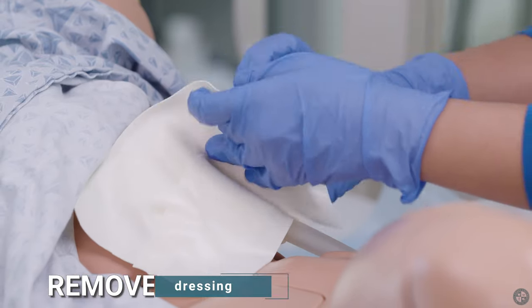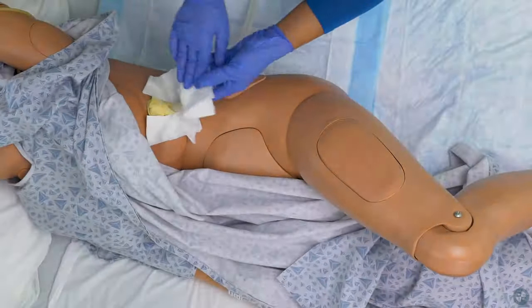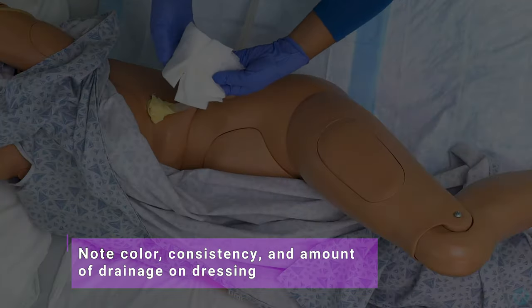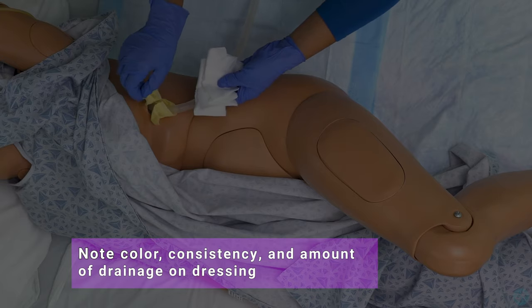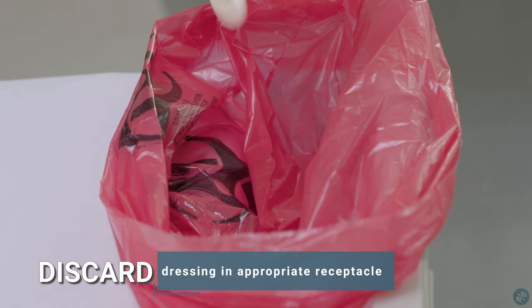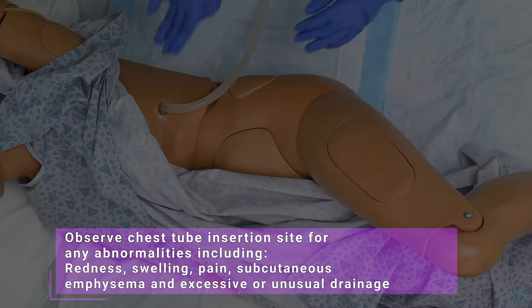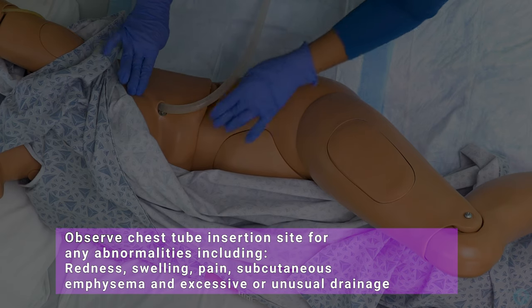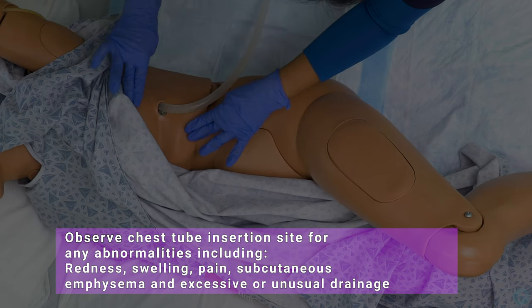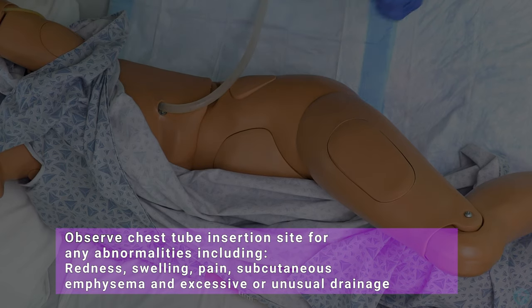Remove dressing. Note the color, consistency, and amount of drainage on the dressing. Discard dressing in appropriate receptacle. Observe the chest tube insertion site for any abnormalities, including redness, swelling, pain, subcutaneous emphysema, and excessive or unusual drainage.